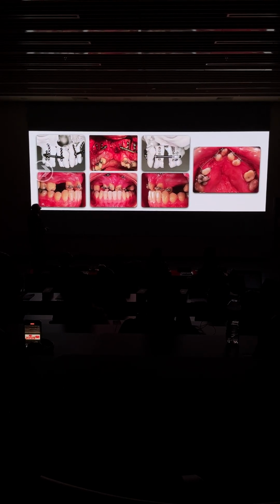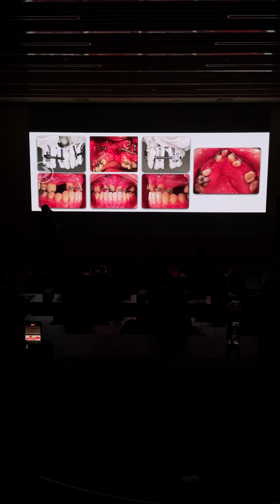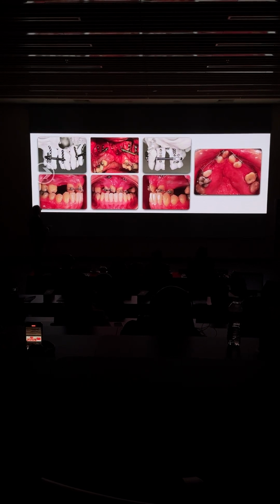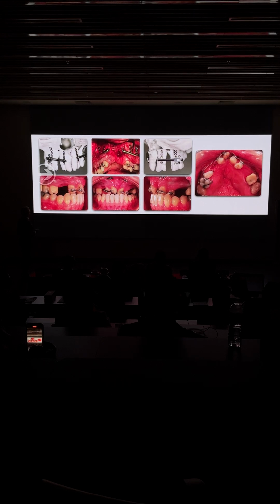I was not involved in all of this. What they did first is the work of the maxillofacial surgeon. They refreshed the bone in the mesial in order to have both blocks welded.